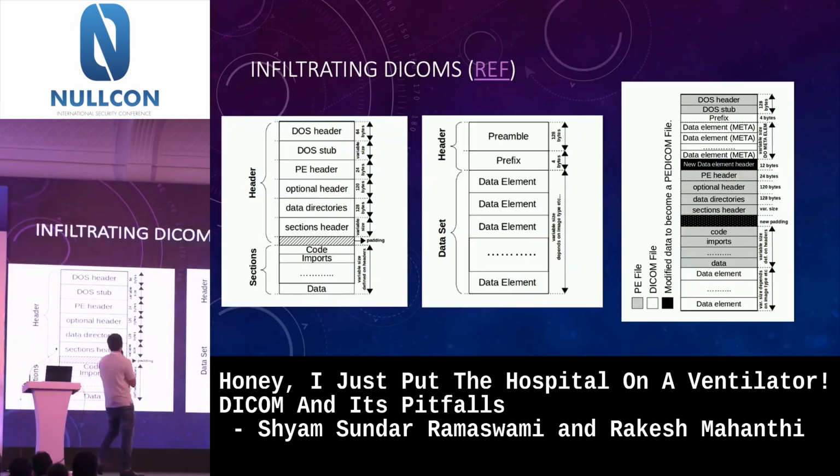Cool. So infiltrating DICOMs. The one you see on the left side is how an exe looks. The center one is the DICOM file, and the one towards the extreme right is the resulting file which we get when we run the script.